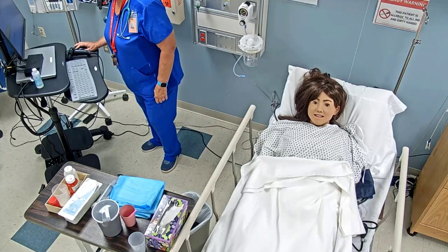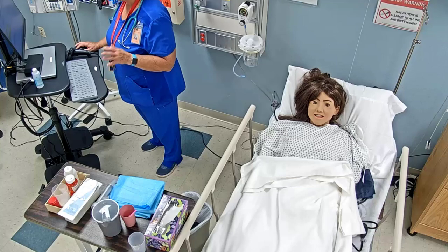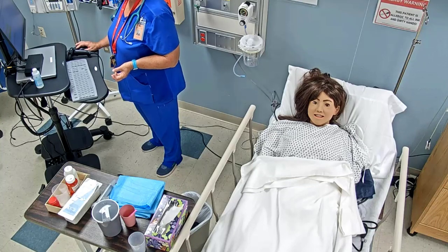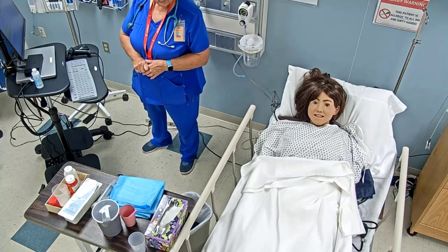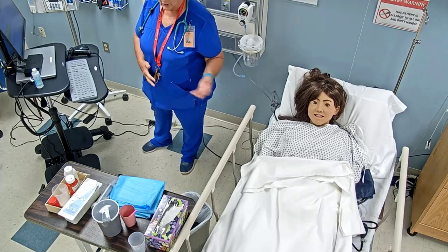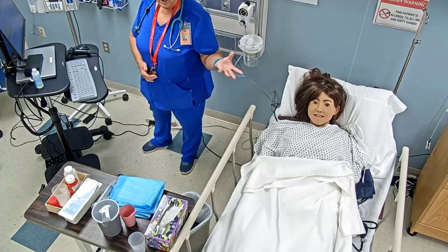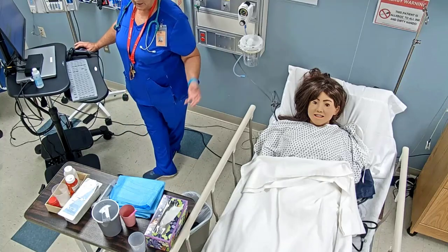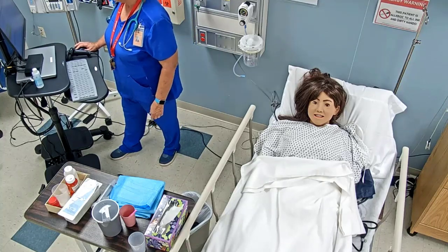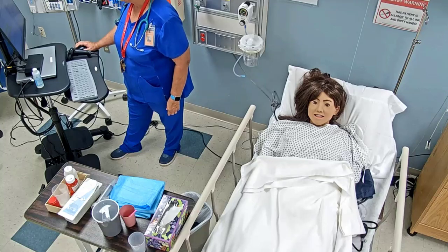So once we have checked our doctor's orders, checked the chart, checked the policy and procedure, we need to also look in the chart to see what kind of learning our patient needs, what kind of education, how do they learn. They're probably going to go home with that PEG. There's a possibility, so we need to make sure we have someone that we can teach how to do that whenever they get home. And so we're doing our teaching on there.